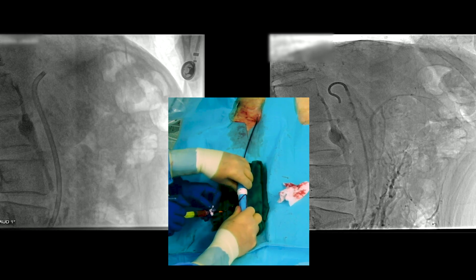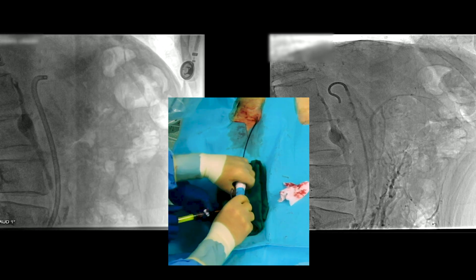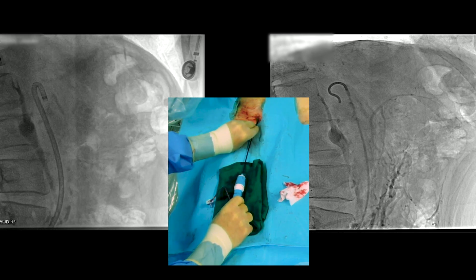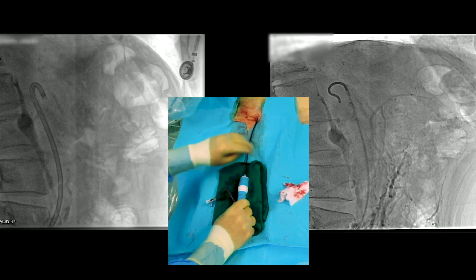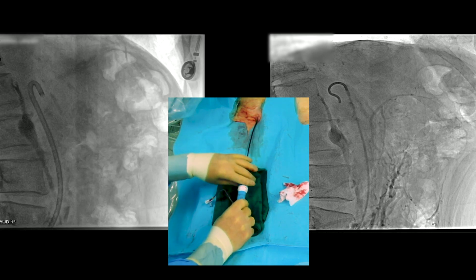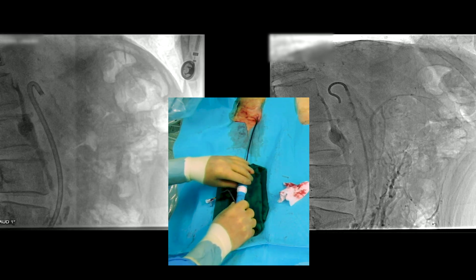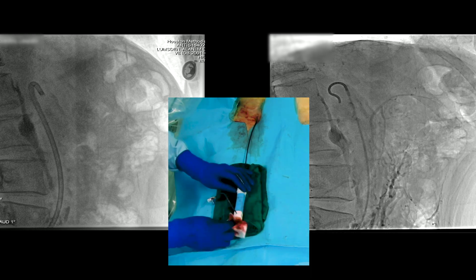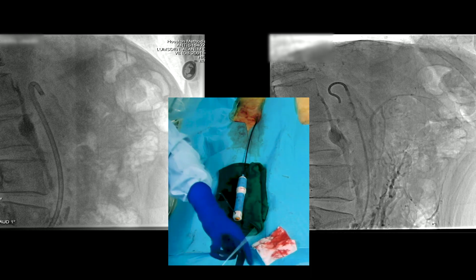Here we're actually bending it. The new name for this is the Tour Guide rather than Aptus sheath, although it was originally introduced for use with the Aptus tacks. Now we're shaping this towards what we think is the origin of the superior mesenteric artery. You can see that long piece of calcification is actually calcification in the superior mesenteric artery.